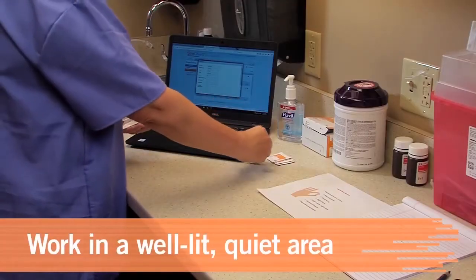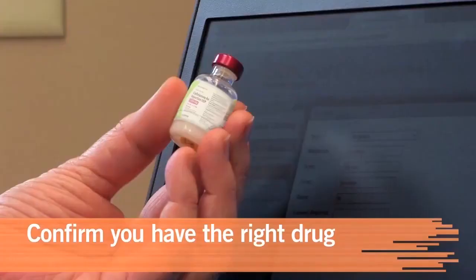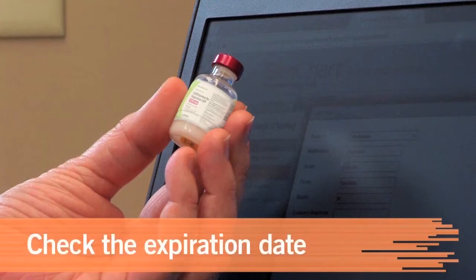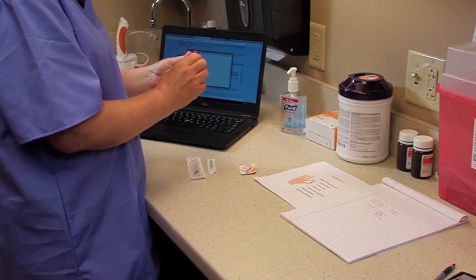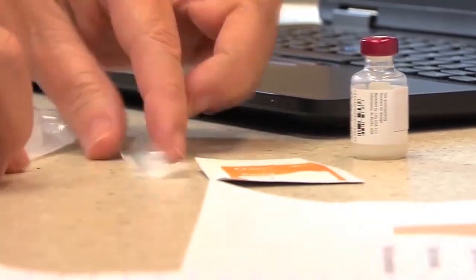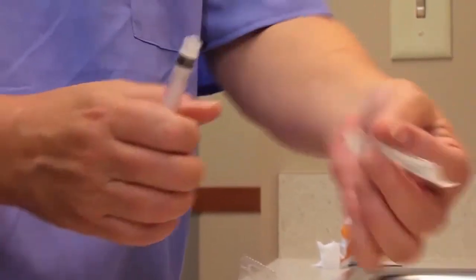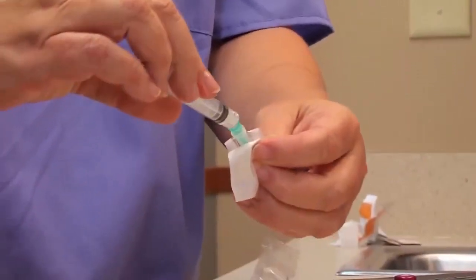Dispense the medication in a well-lit, quiet area. Compare the order with the label on the vial to confirm that you have the right drug for the right patient. Check the quality of the medication and the expiration date. Dispose of the medication if it appears contaminated, contains sediment, or has expired. Assemble your equipment. Be sure to choose the correct syringe and needle unit based on the administration site, the patient's characteristics, and the amount of medication to be injected. Remember, you have the right to prevent errors.